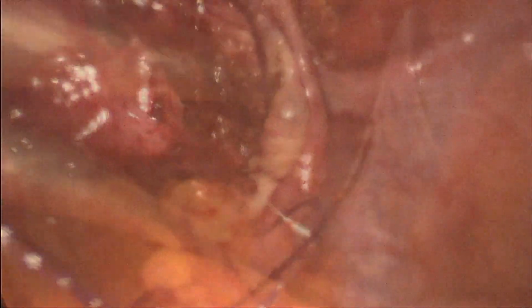While taking bites through the lateral ends, care should be taken that the needle does not go out of the uterus, where there may be inadvertent injury to the vessels in the broad ligament.